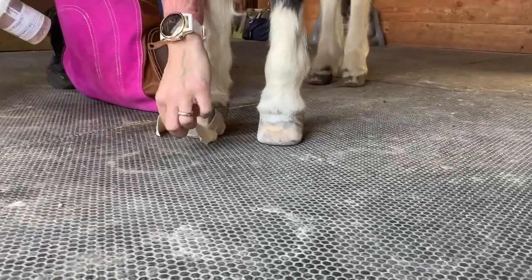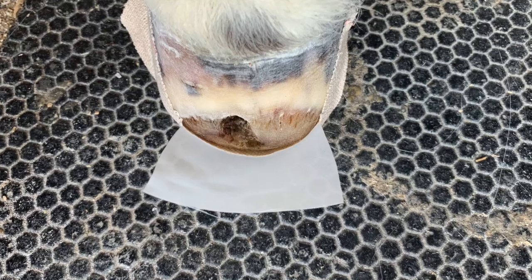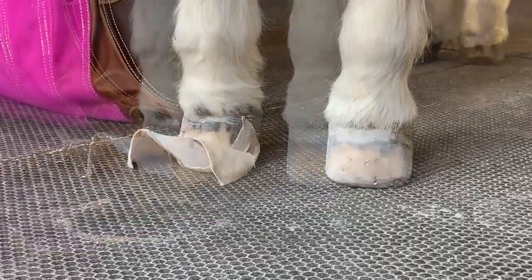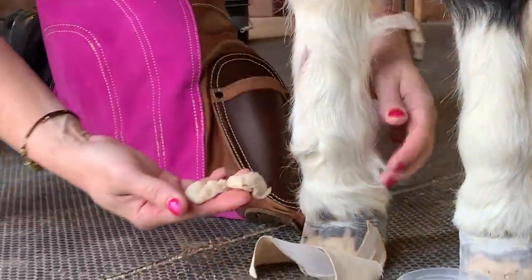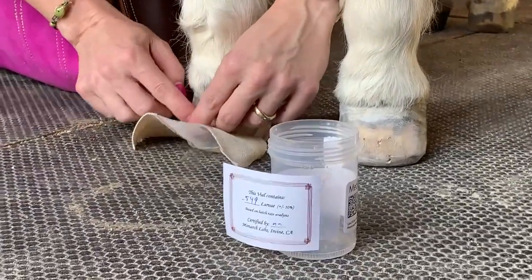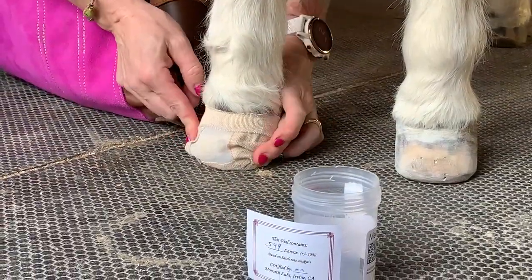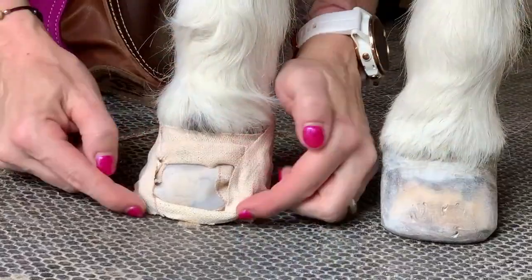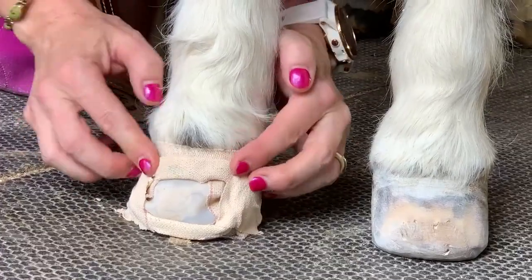We've got our window, our little dressing pre-prepped here. I'm going to open our jar — they're all in there. Do you see them? We're just going to take our little gauze, put it here at the front and then seal them in. See how I've effectively made a containment bandage here for them? See how I've built him a little framework here so that it's a little bit protected from getting crushed.